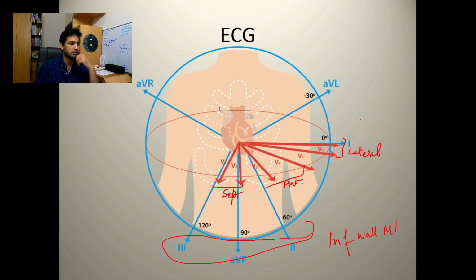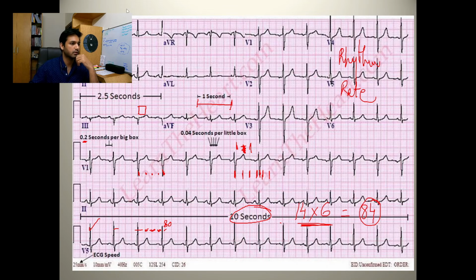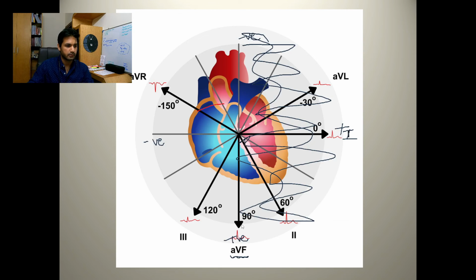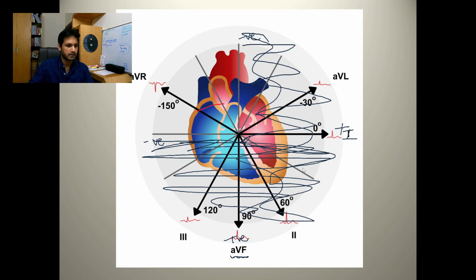All right. So lead 1, the QRS was positive, and then coming back to AVF, even though it is very small, it's still considered positive because the negative side is very small and the positive is longer, so we'll consider it as being positive. So over here, we are on the positive side, so we'll shade the positive side of the AVF. Now, where the overlap happens is your axis.